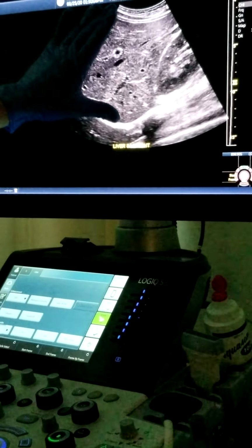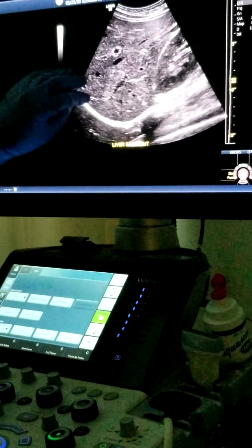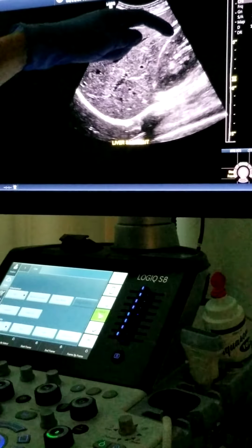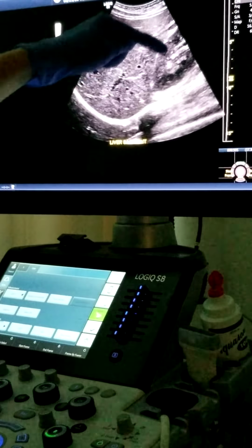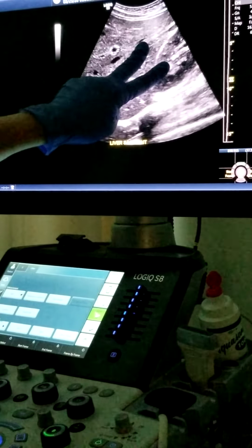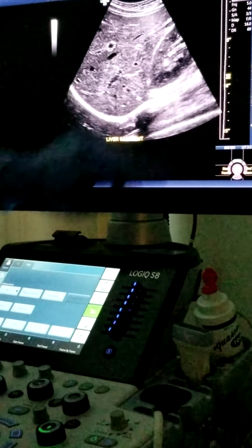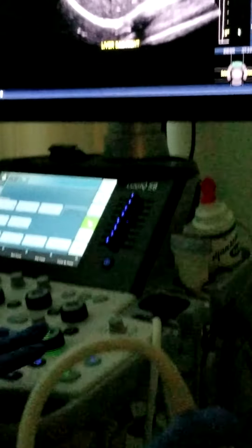And again, I'm focusing mostly on liver, so I have as much of that right lobe as I can, but I'm showing this interface here. For a couple reasons, we're going to look at Morrison's pouch here, which is that potential space. Make sure that there's no free fluid between these two structures. And then we're also comparing the echogenicity of the liver to the right kidney.